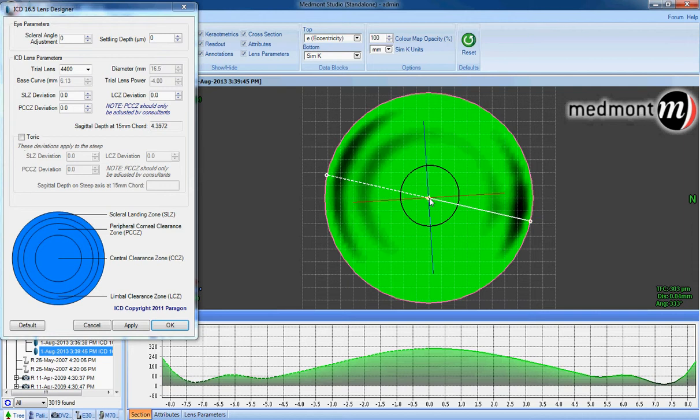In this case, the lens appears to land very close to 3 o'clock on the conjunctiva and again near to 9 o'clock on the conjunctival surface.